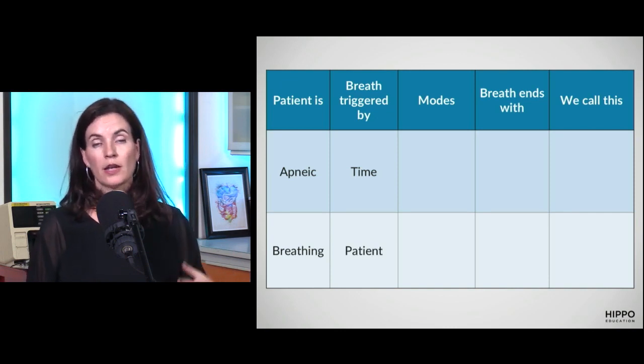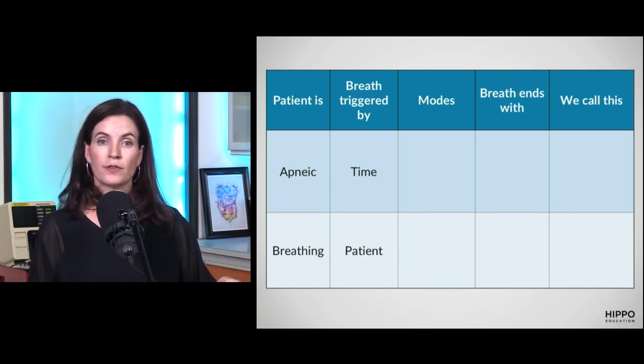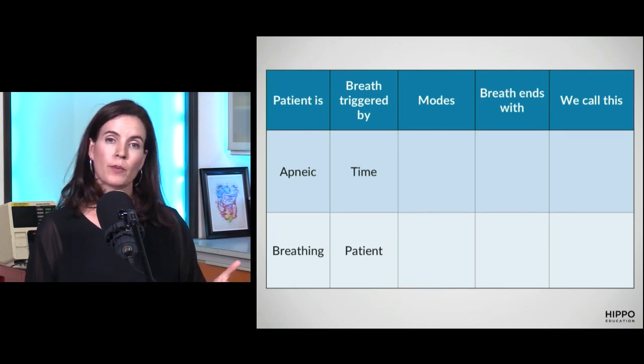Whereas if your patient is awake and breathing, they will trigger the breath themselves. They will start to inhale, the vent registers this pressure deflection, and then will help them by delivering a breath. So really it's like a difference between a paralyzed patient and a non-paralyzed patient. Exactly. Or a dead patient and a not dead patient. Yes, and hopefully if you're ventilating them for a long time, they're at least partially alive. Exactly.